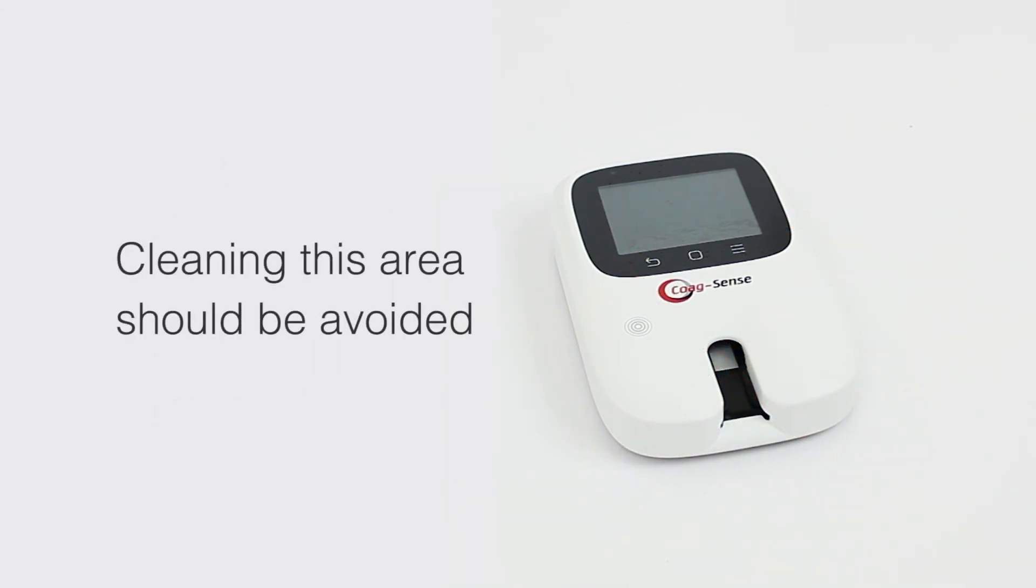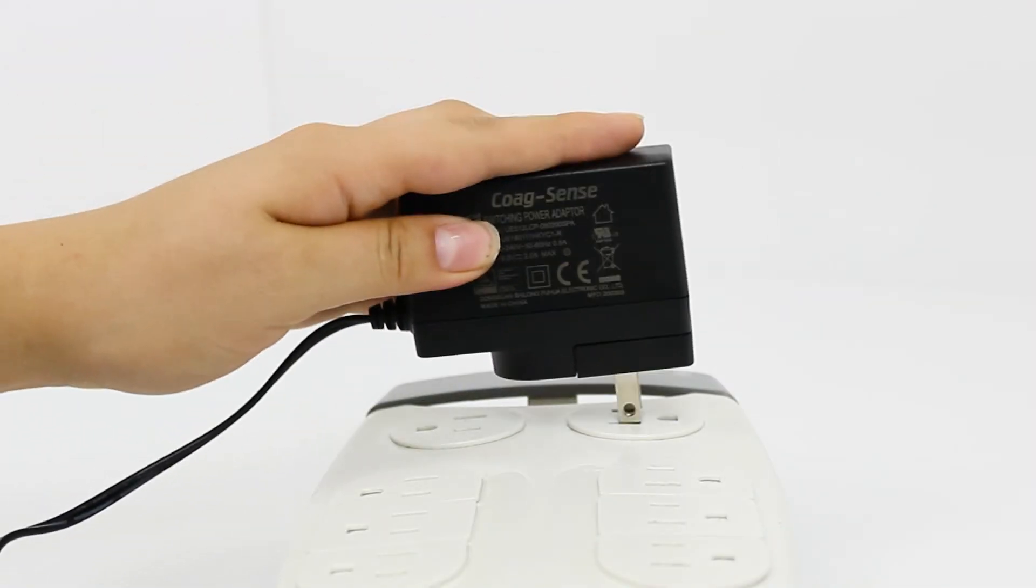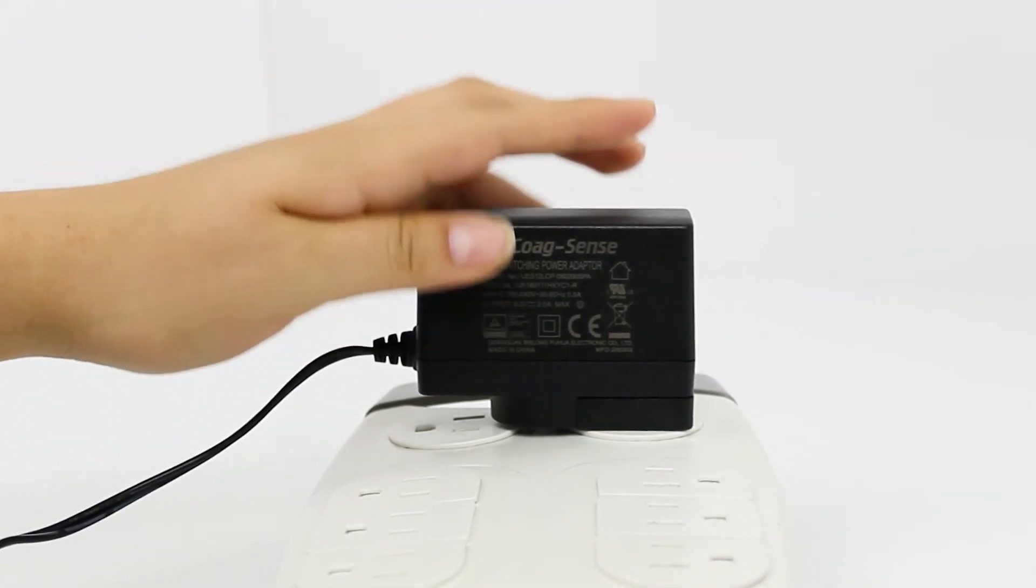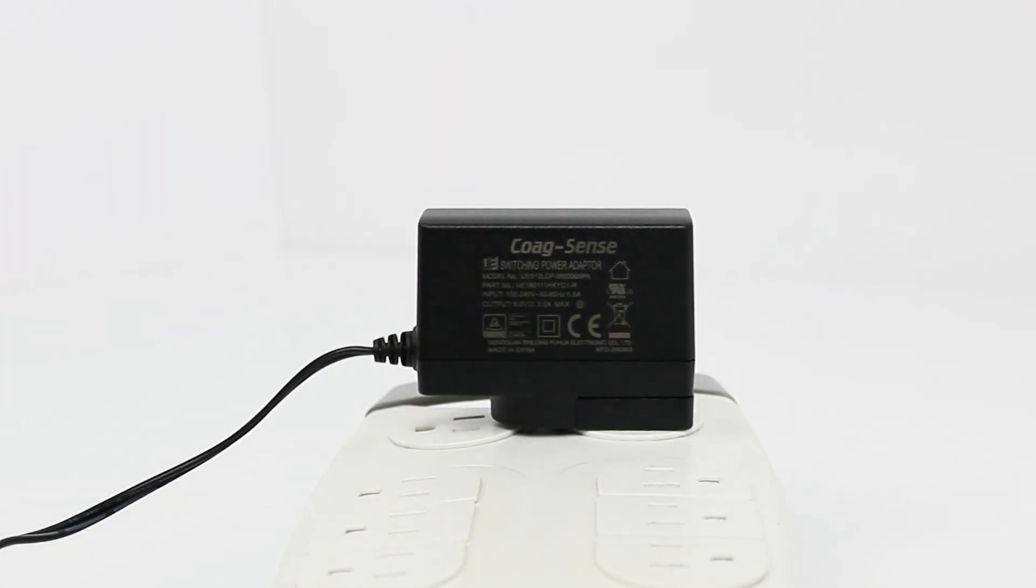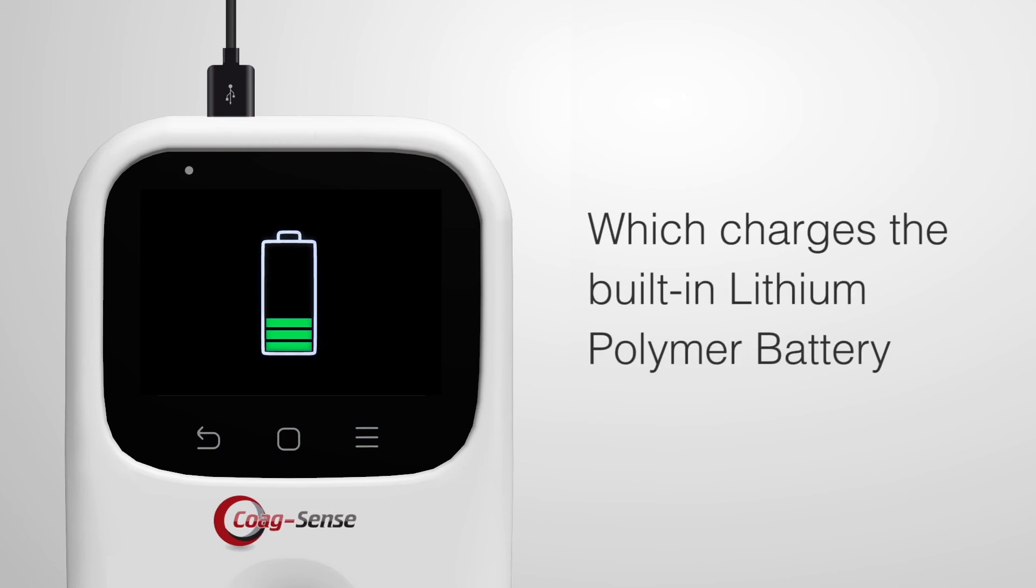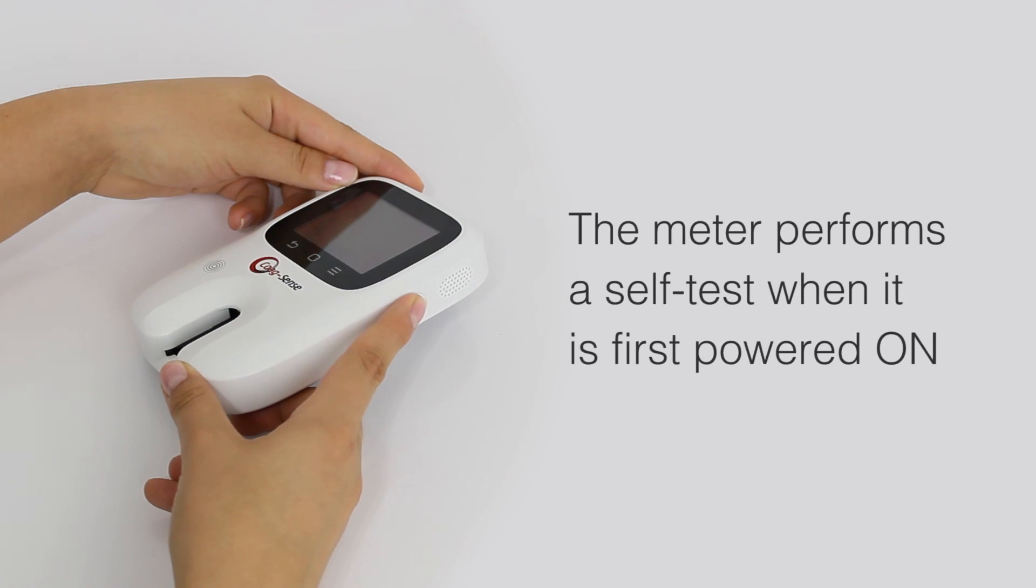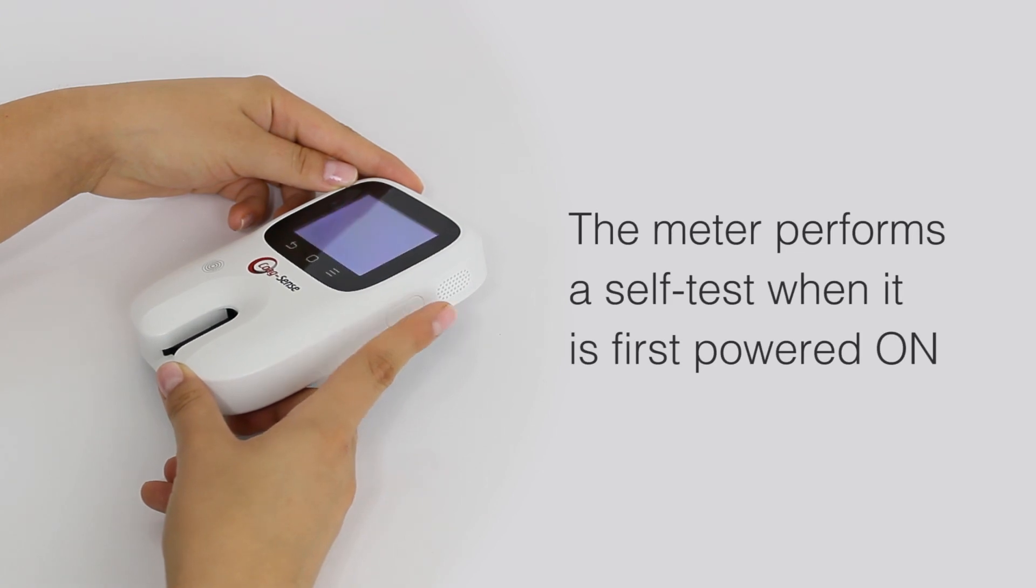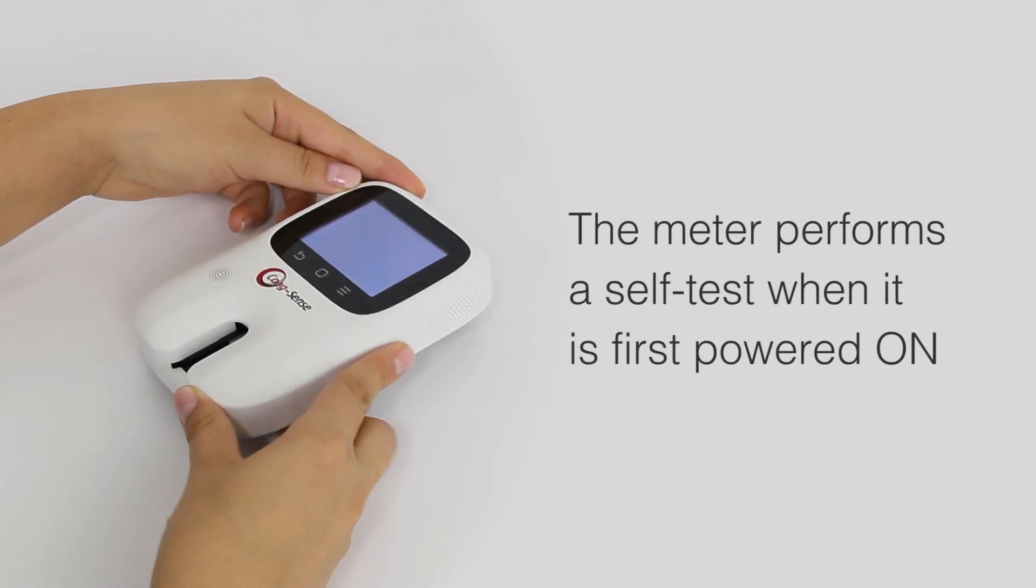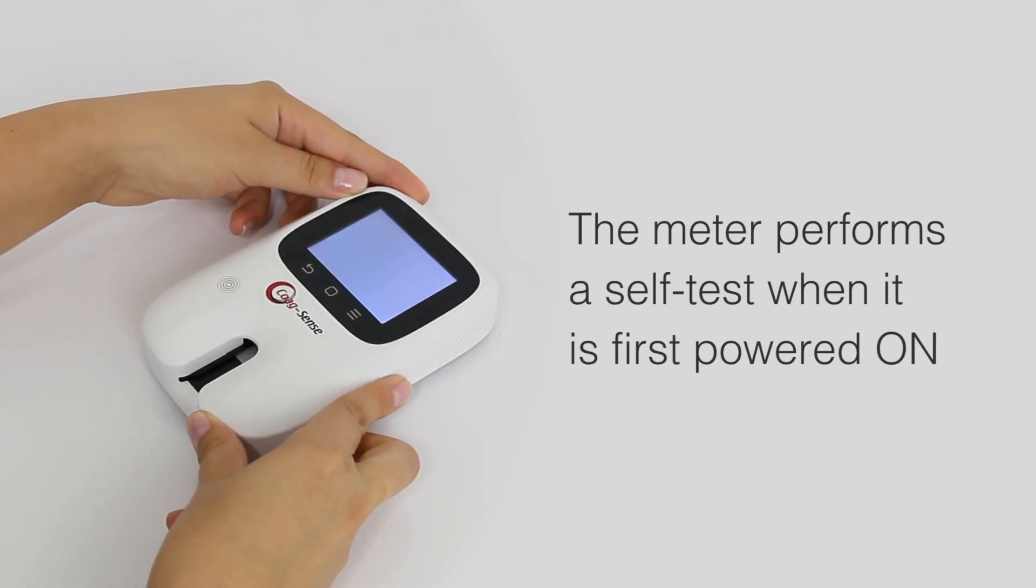The meter can be operated with the power adapter provided in the kit, which charges the built-in rechargeable lithium polymer battery. The meter performs a self-test when it is first powered on.